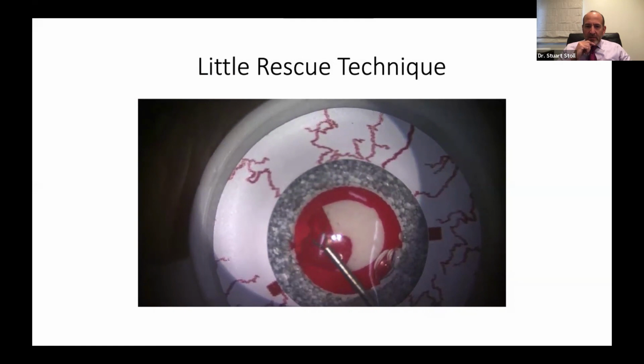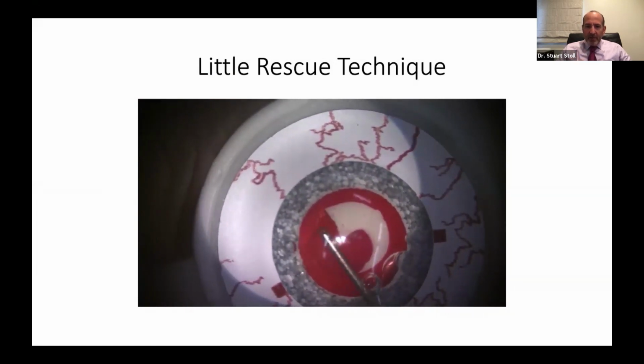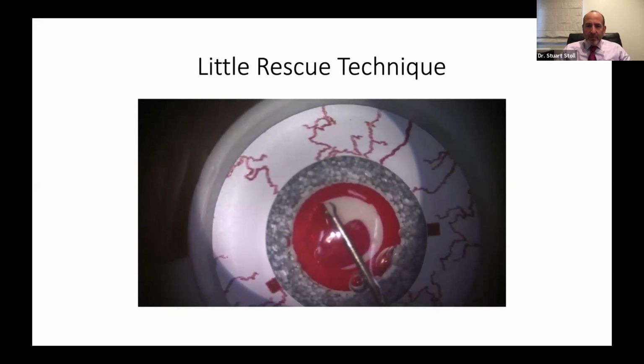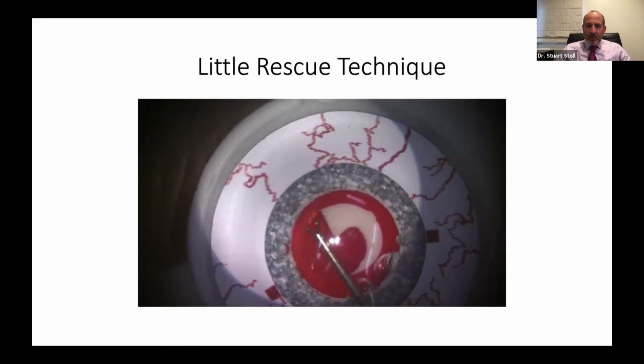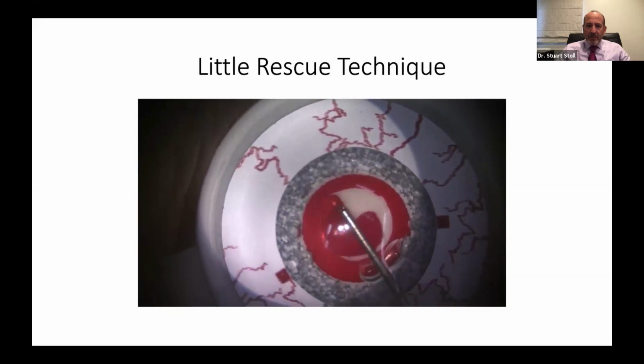Notice that the tear is running out. We're gonna recognize it early. We're gonna fold the capsule back over. This would be a great time to put viscoelastic in. We're going to get that capsule in position so that we can do the tear.